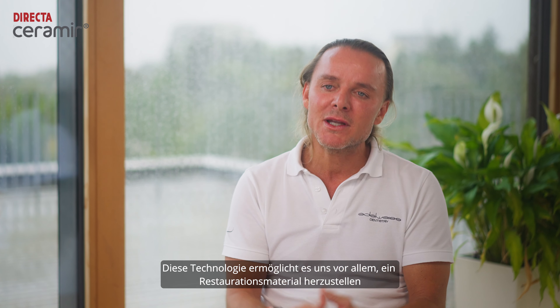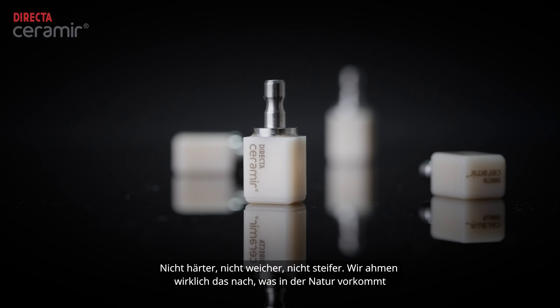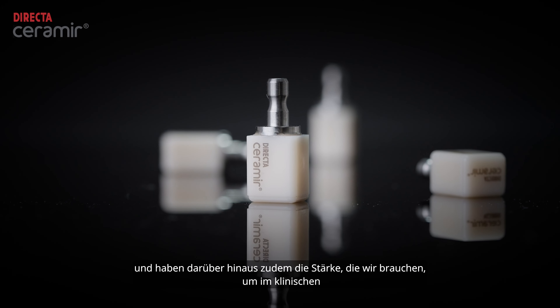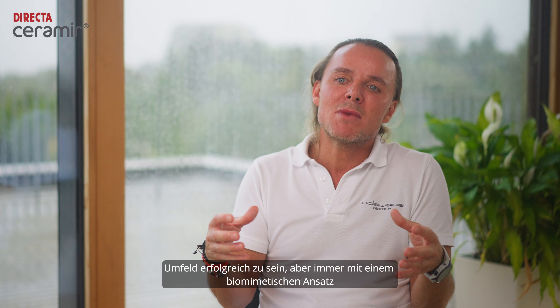The technology, first of all, allows us to fabricate a restorative material which mimics the natural tooth in regards to mechanical behavior — not harder, not softer, not stiffer. We really mimic what is found in nature. And on top of that, of course, the strength which we need to succeed in the clinical environment, but always on a biomimetic approach.